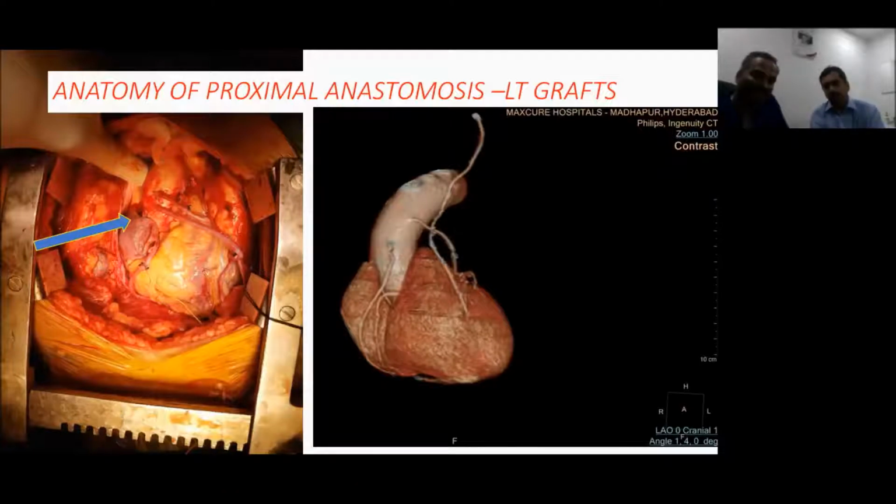For me, even if it's immediate graft occlusion, what I'll have to do is go back. Say if lateral wall ischemic changes are happening, then for me, I have to go and check the LAD, OM and distal OM grafts, all the grafts. Whereas if you tell me on an angiogram that only the OM graft is occluded, then fantastic for me. I'll just go there and deal with it and come back. So it's always better to be guided. It's just like what we do before surgery, guided by the angiogram. That's a roadmap. So post-op, if new changes have come, the roadmap has changed. So go back and find the map and then do what is needed.